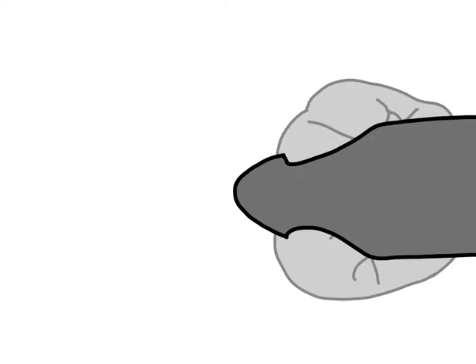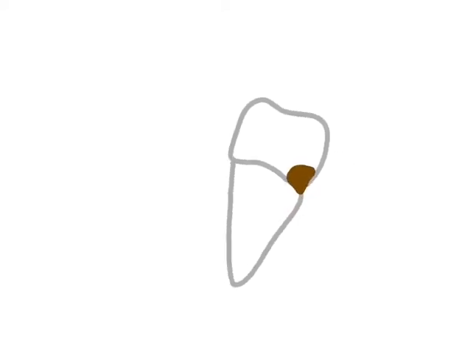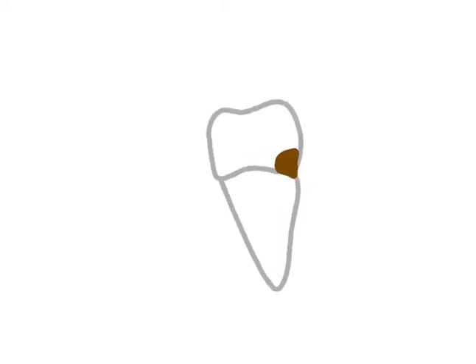For teeth with straight conical roots, this rotatory movement itself is enough to permit their detachment from the socket. Only if there is any resistance felt, then buccolateral movement is utilized to deliver the tooth. The delivered tooth is inspected to ensure that it is complete, and compression of the extracted socket is done with left thumb and forefinger, which supports healing.